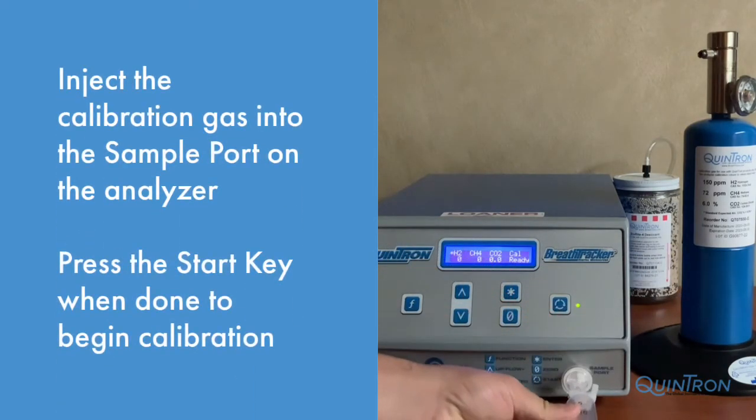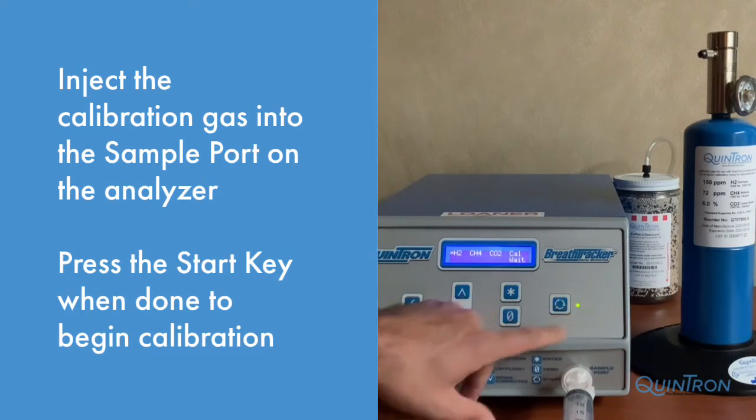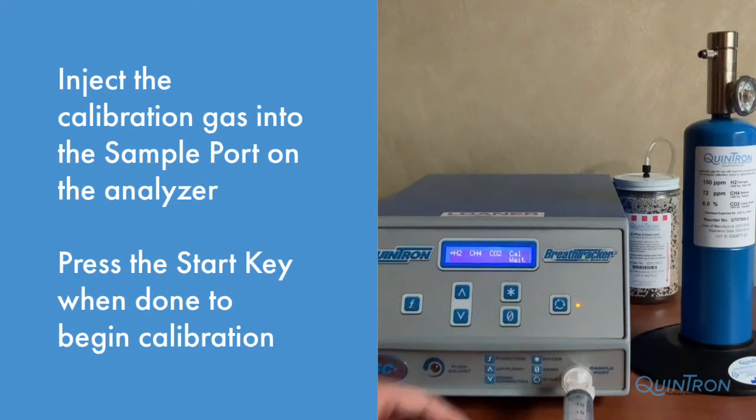Insert the stopcock into the sample port on the front of the analyzer. Open the stopcock, inject all of the gas, and press the Start key to begin calibration analysis. The light will turn amber.